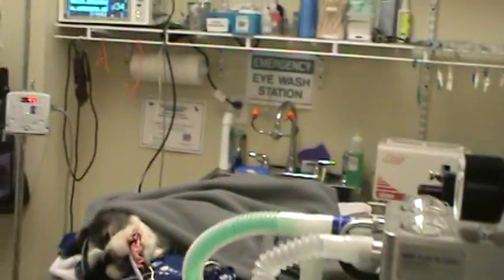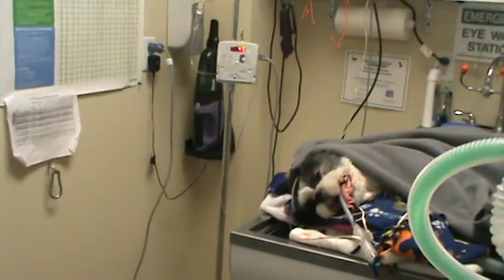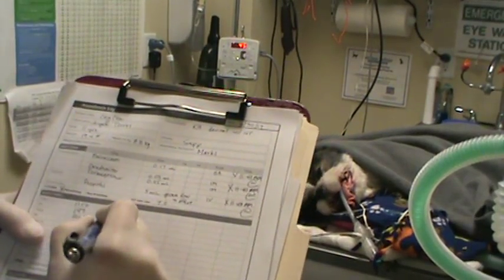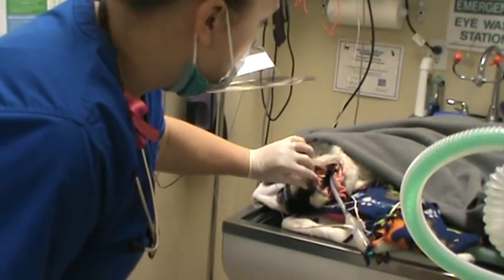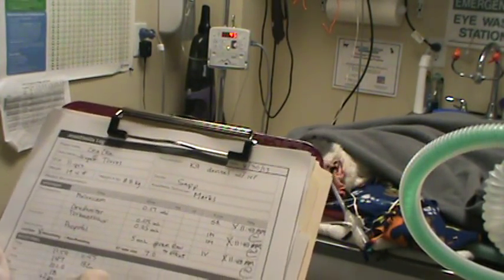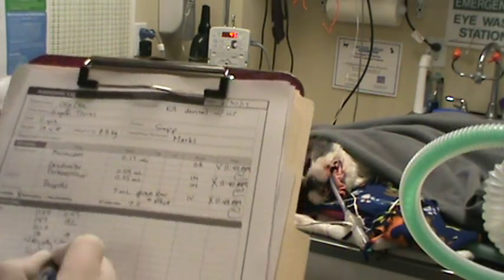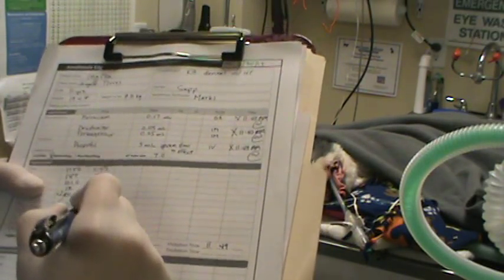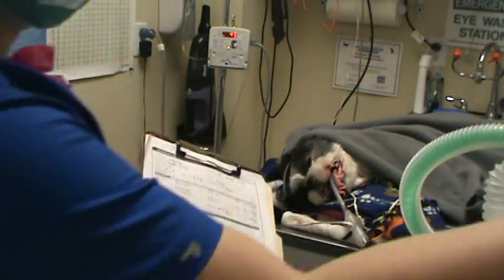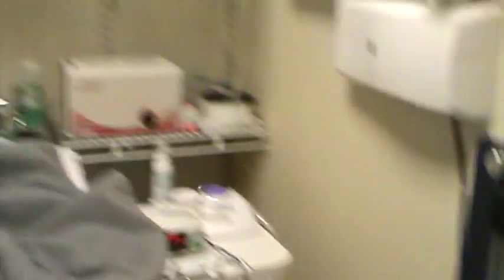SPO2 down there is reading 96 — that's good, we'll record that. Respiratory rate is nine. CRT is pink and two seconds. We flipped our patient so the doctor could do her surgery on that one side first. We went ahead and turned her down just a little bit — she's now on two percent isoflurane and one liter of oxygen.